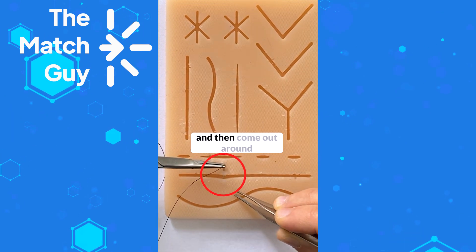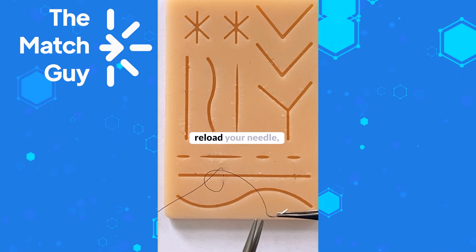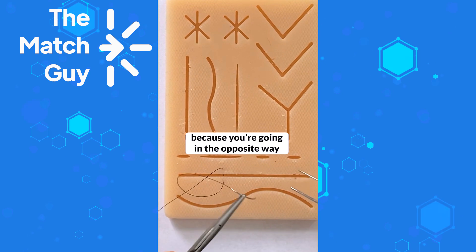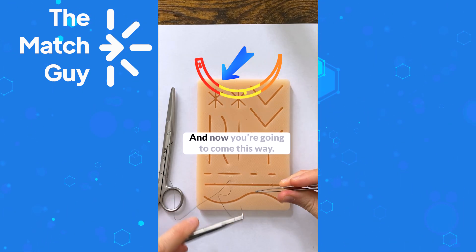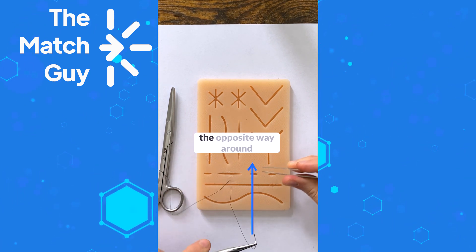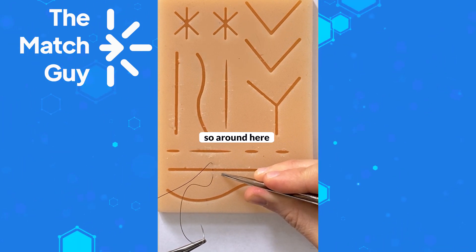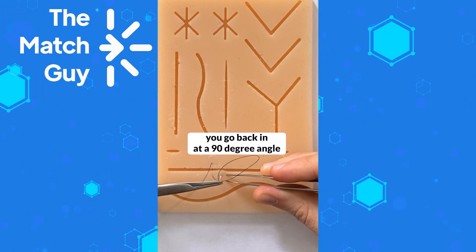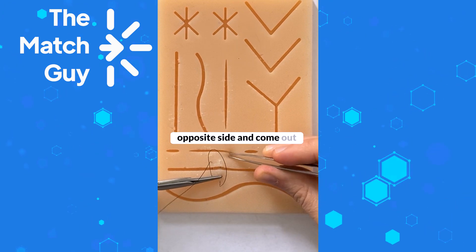Come out around half a centimeter from the wound, then pull and reload your needle. Now you're going to do it backhanded because you're going in the opposite direction — again, between the upper and the middle third. You came this way, and now you're going the opposite way, around half a centimeter to a centimeter from where you exited. Go back in at a 90 degree angle around half a centimeter from the edge of the wound on the opposite side and come out.